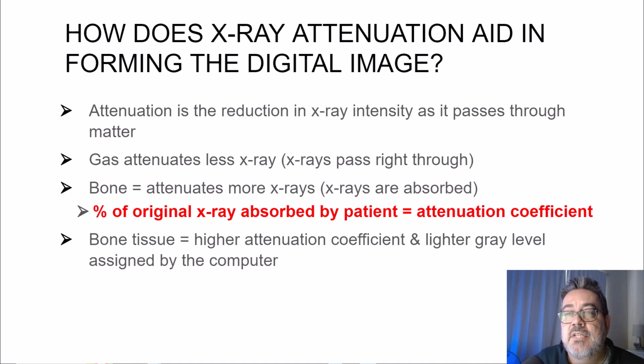I'm going to go on a little tangent real quick, just because you happen to see a lot of techs getting lazy out there and they don't adjust technical factors, like ever. You have to consider subject contrast when you plan to use optimum radiographic technique. What do I mean by that?